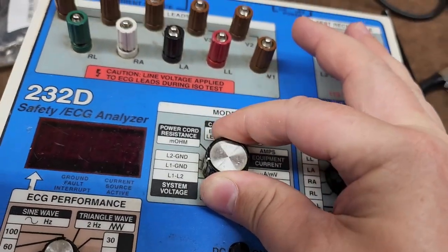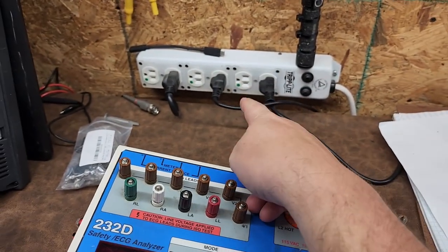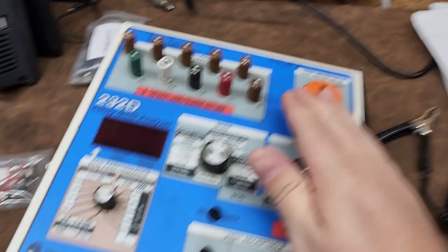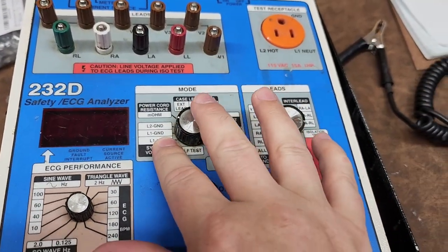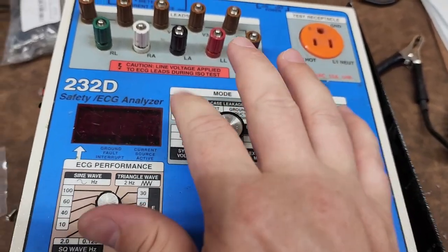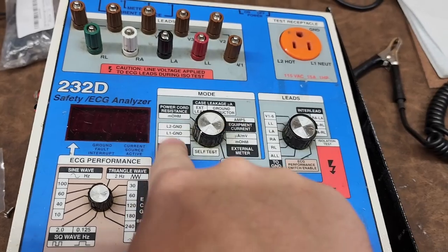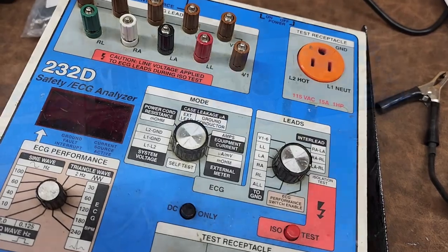So this guy here helps you quickly diagnose your electrical system — you just have to have some comprehension of what each pin is supposed to do. I love analog functions because, as an advanced troubleshooter, this helps me get to the meat and taters of the problem a bit quicker. Equipment current — I use that one quite often.